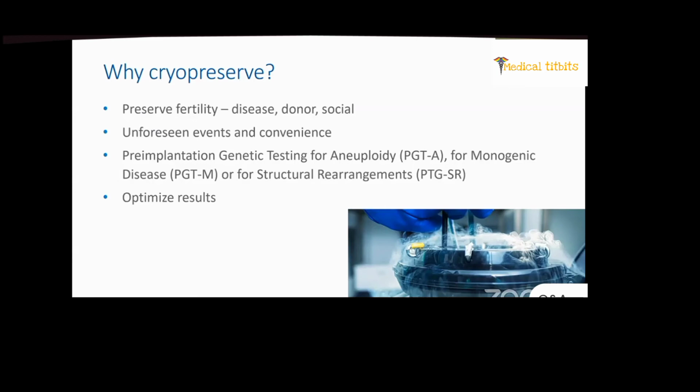For example, we may have to cryopreserve oocytes until a later cycle of treatment due to unforeseen events, such as when a semen sample cannot be produced on the day of oocyte retrieval. Mostly, we cryopreserve embryos and blastocysts in freeze-all cycles, when we have surplus good quality embryos, and for temporary embryo storage while awaiting test results from pre-implantation genetic testing or PGT. Also, we now know that optimization of clinical outcomes can be achieved with more physiologically timed elective frozen embryo transfers.